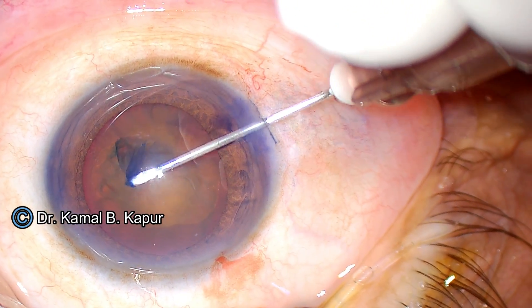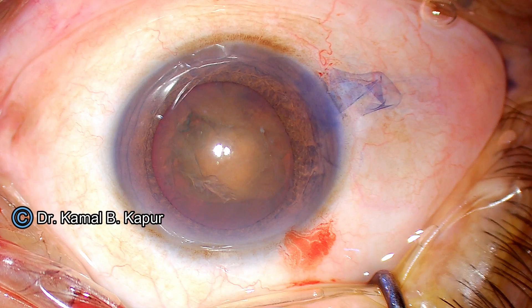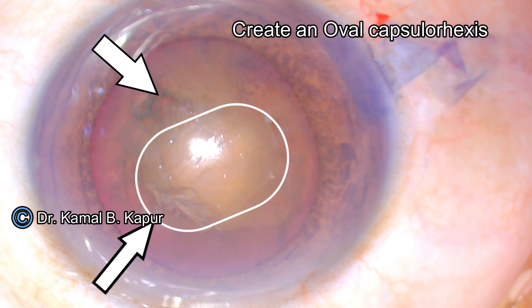This oval rhexis is going to help in case of a PC opening to place our lens perpendicular to the linear axis of the rhexis, and it will also help us to remove the D segments without rotation.